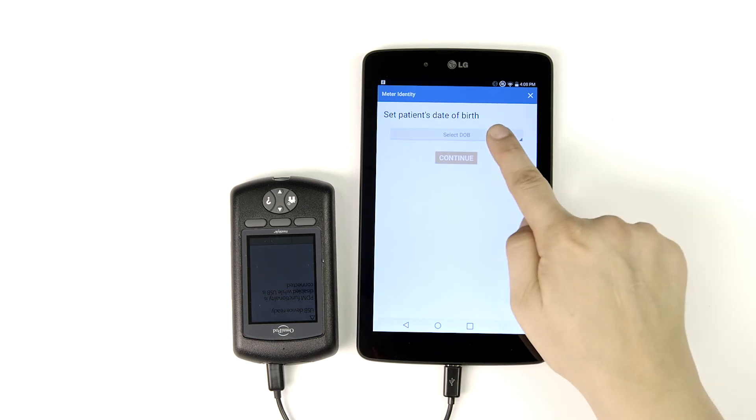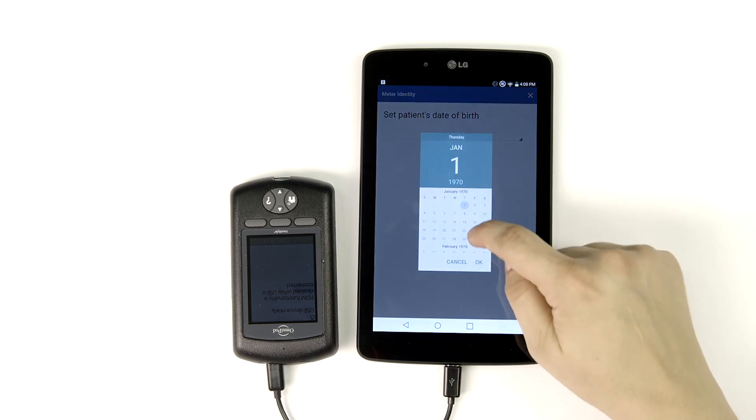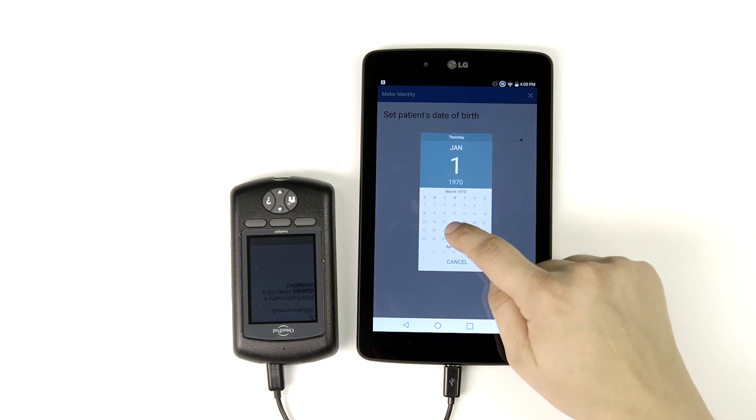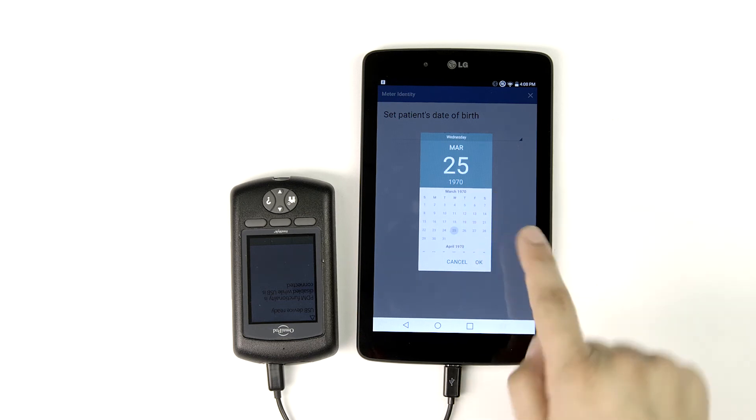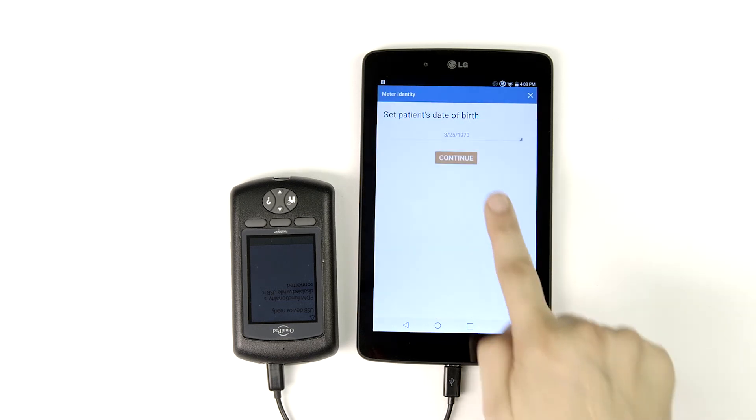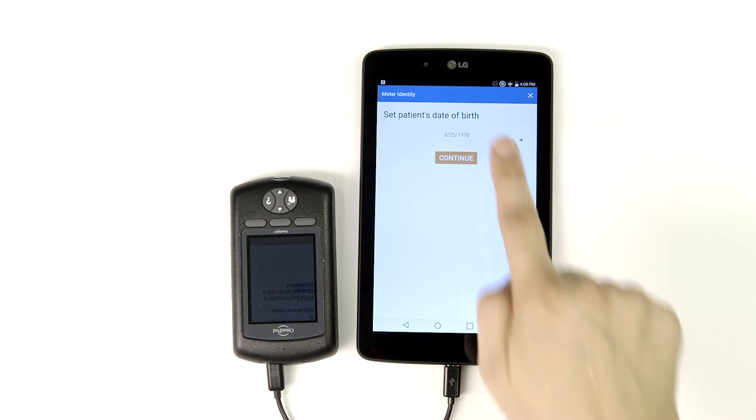Tap select DOB to enter your patient's date of birth. Tap OK when finished, followed by continue.